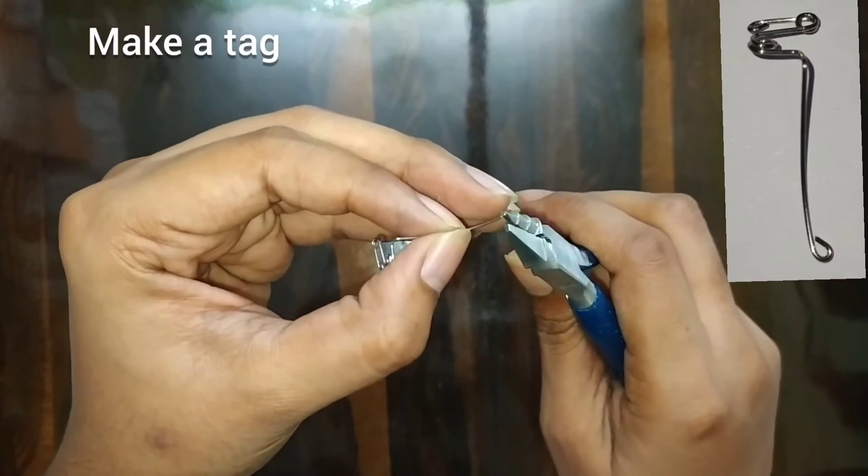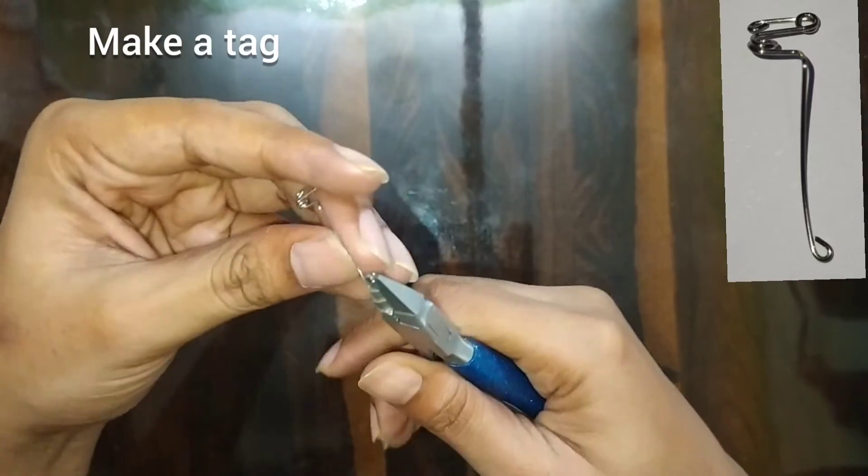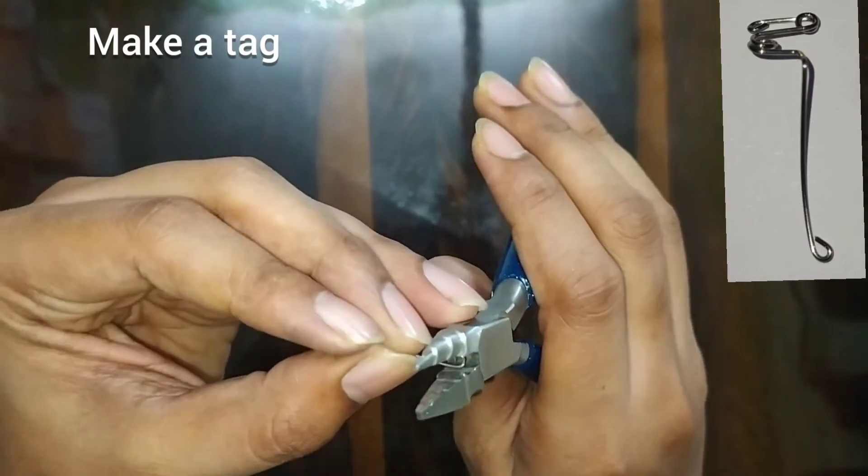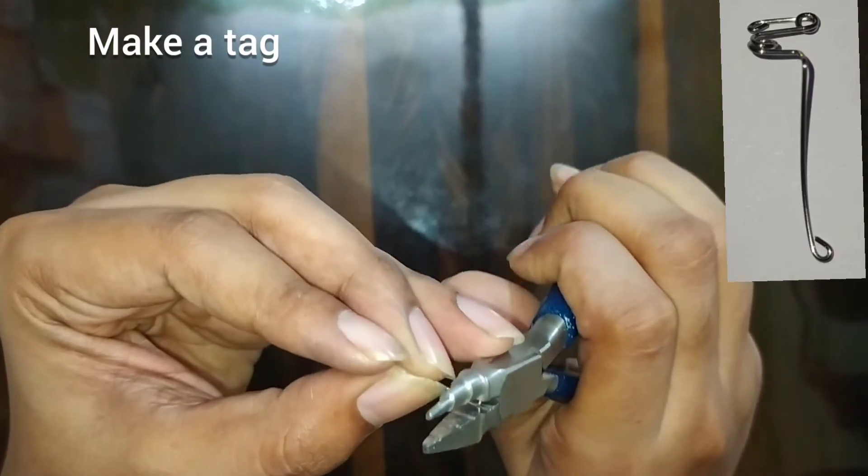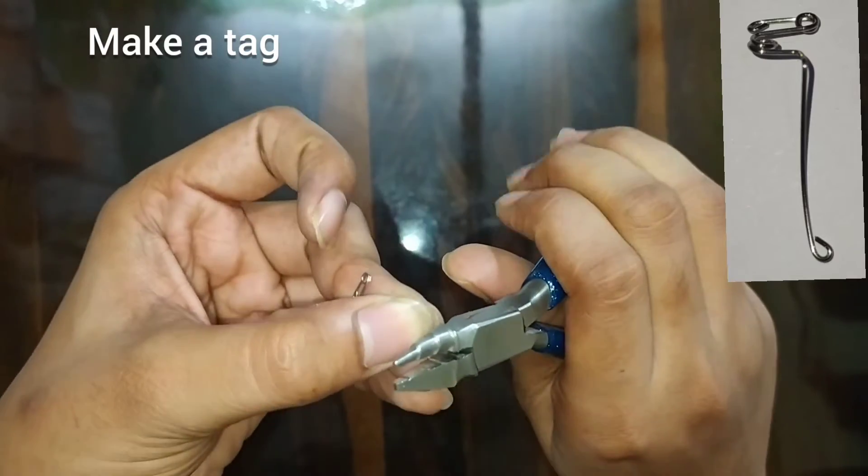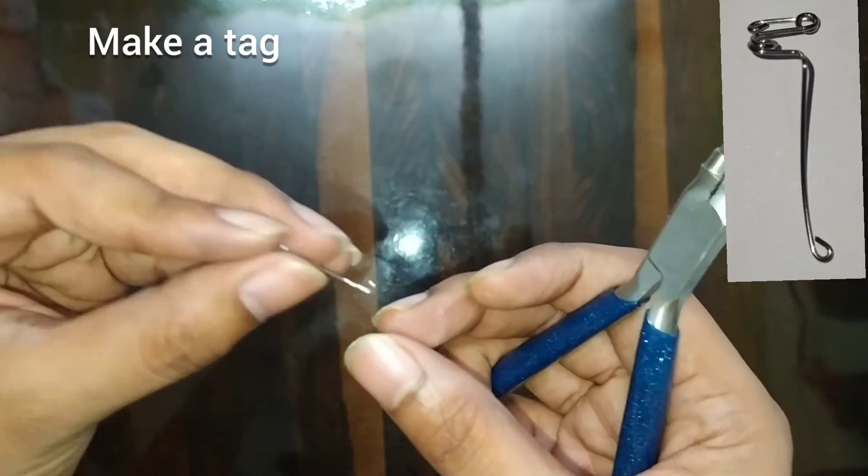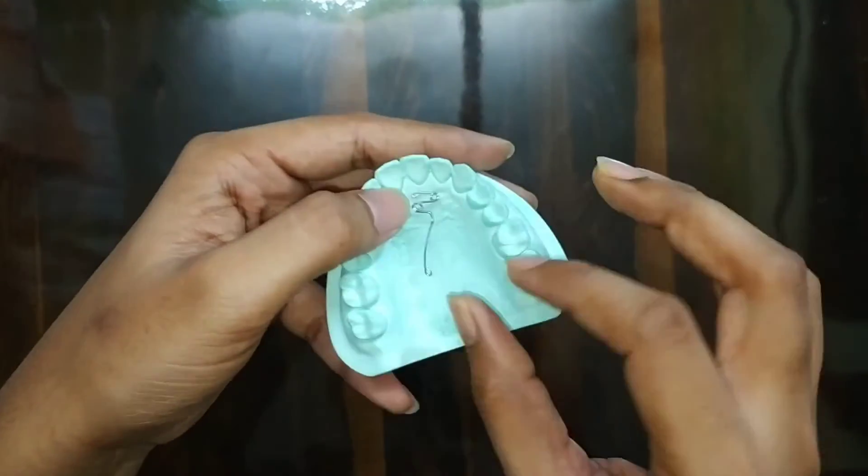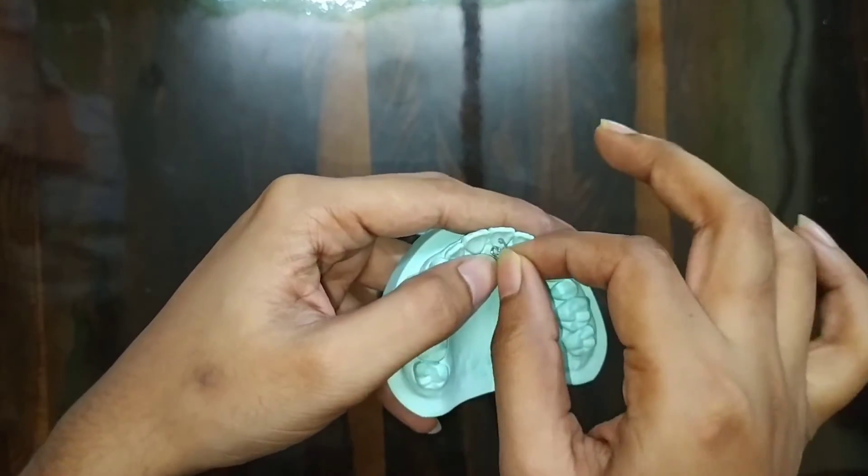After this, make a small tag at the end of the wire. In this way we can see here our Z spring is ready.